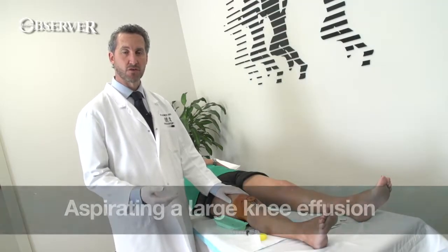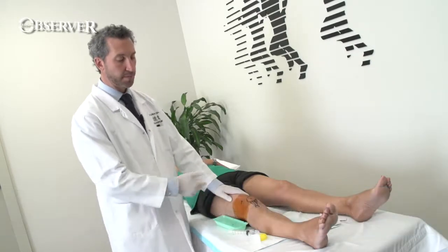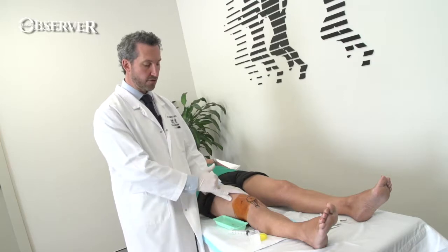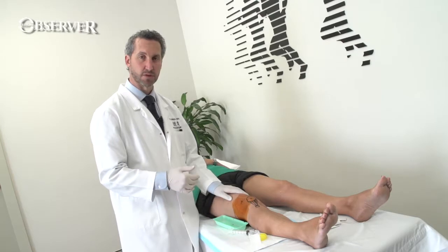We typically only drain effusions if they are very large, and I find the easiest way to do it is with the patient supine, entering into the suprapatellar pouch. You can aspirate with the knee flexed, but I find that more difficult.